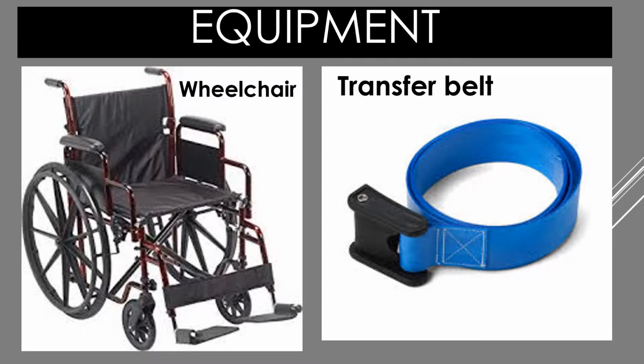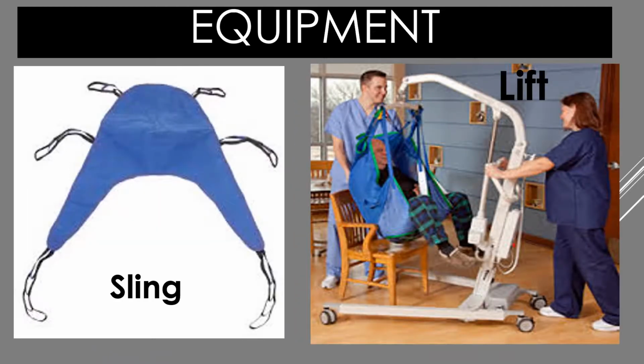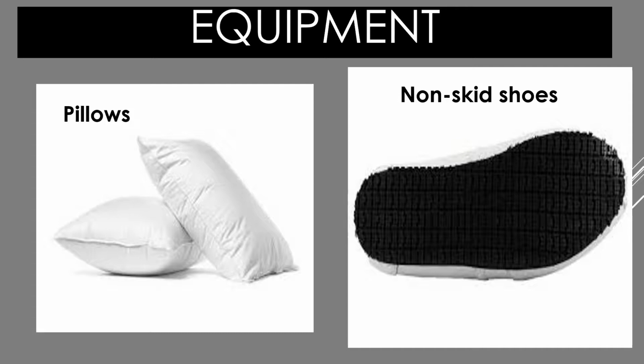The following are equipment used for patient transfers: wheelchair, transfer belt, sliding board, draw sheet, sling, lift, pillows, and non-skid shoes.